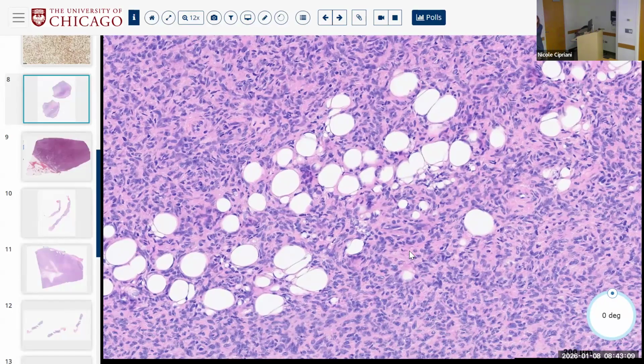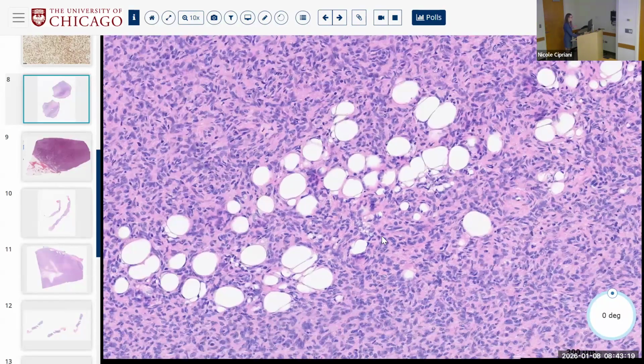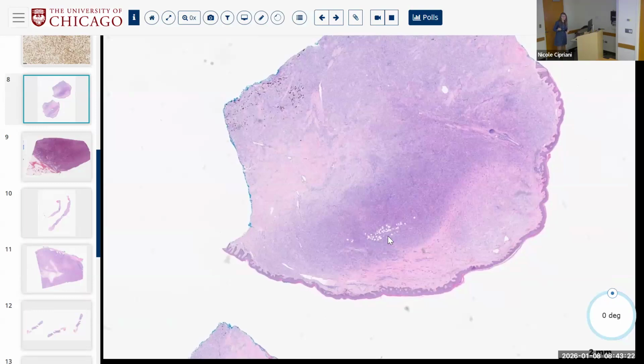So even without a stain, this is DFSP. This would be diffusely, strongly CD34 positive. If you're thinking about dermatofibroma, it would not be this deep, diffuse, or infiltrate fat like this, and it should be CD34 essentially negative or very weak, only at the periphery. So DFSP.